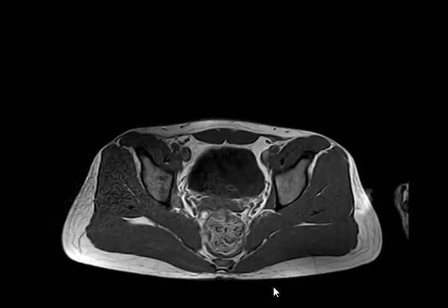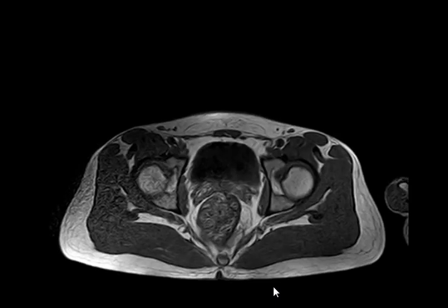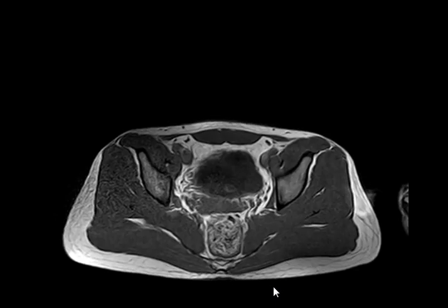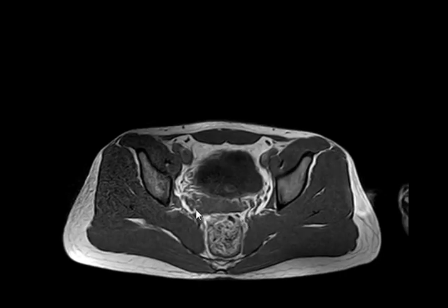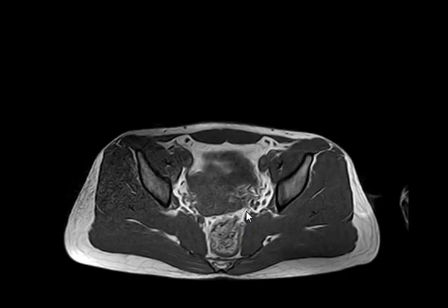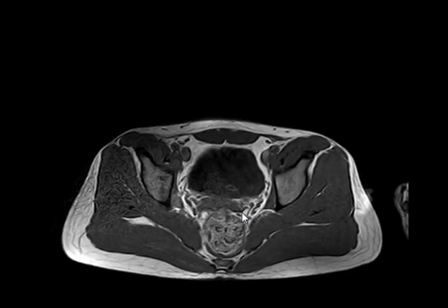So first of all, we have a small sized uterus, right? This structure, it's a vagina. So maybe rudimentary vagina, maybe open to the skin. Any clinical examination of the perineum will be helpful in that. But it is high for vagina. But the thing is, we are here.